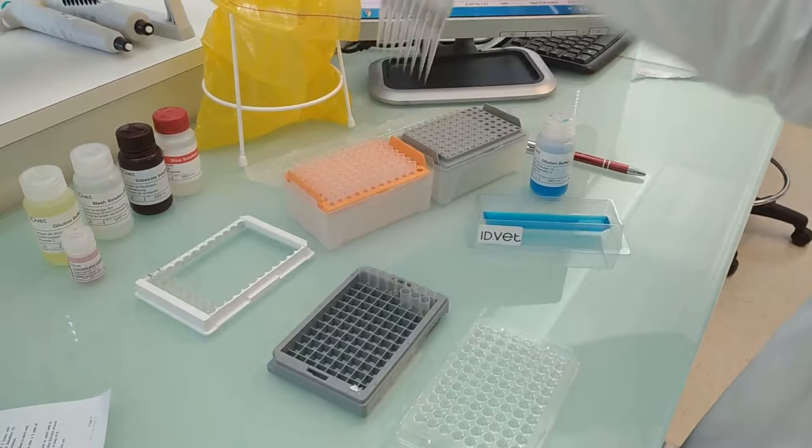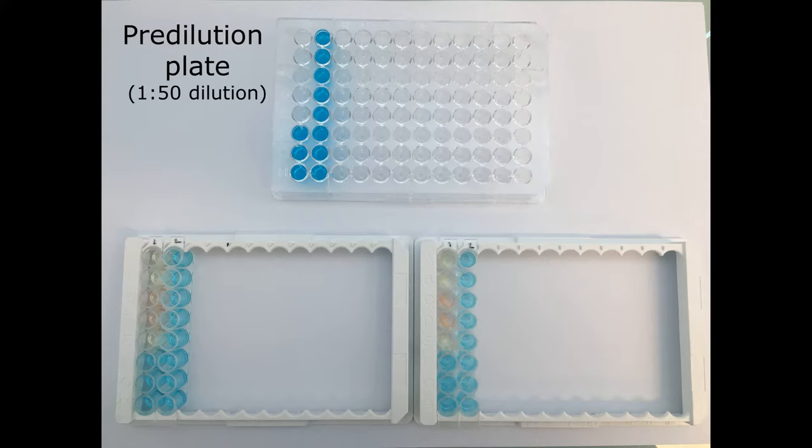At this step, the samples are 1 to 50 diluted. Thanks to standardized protocols across the avian ELISA range, you may use the same predilution plate to test for multiple diseases.